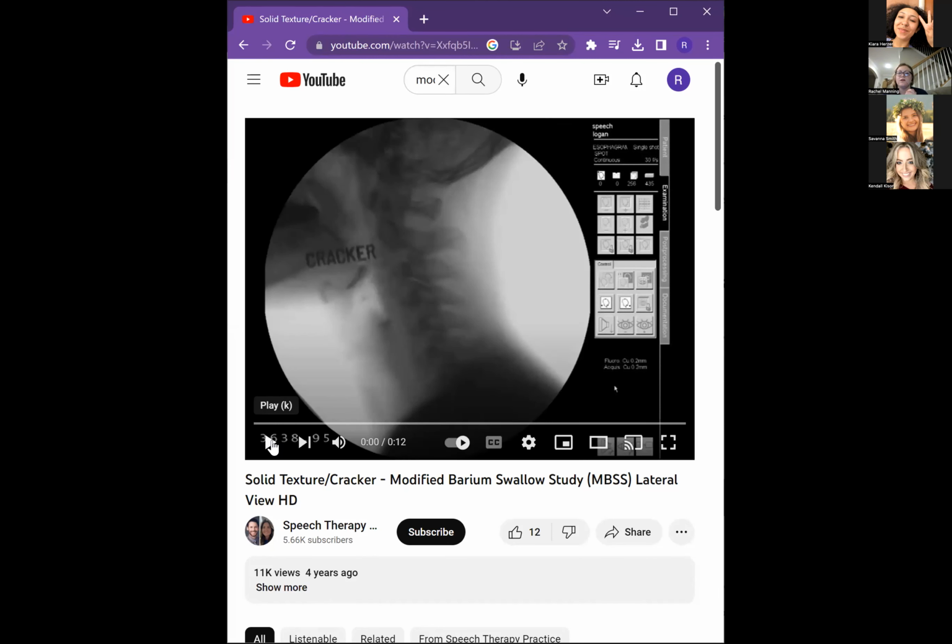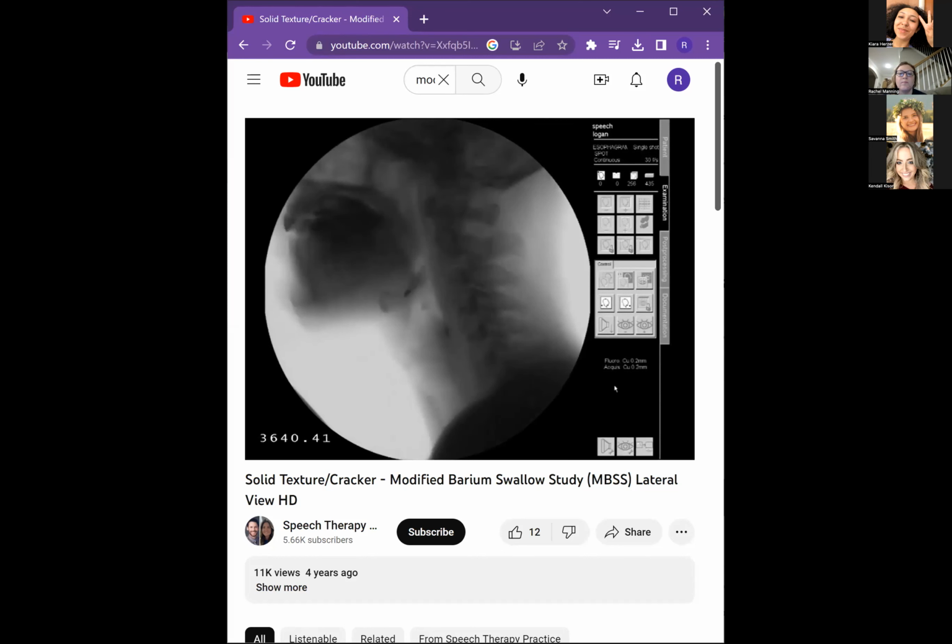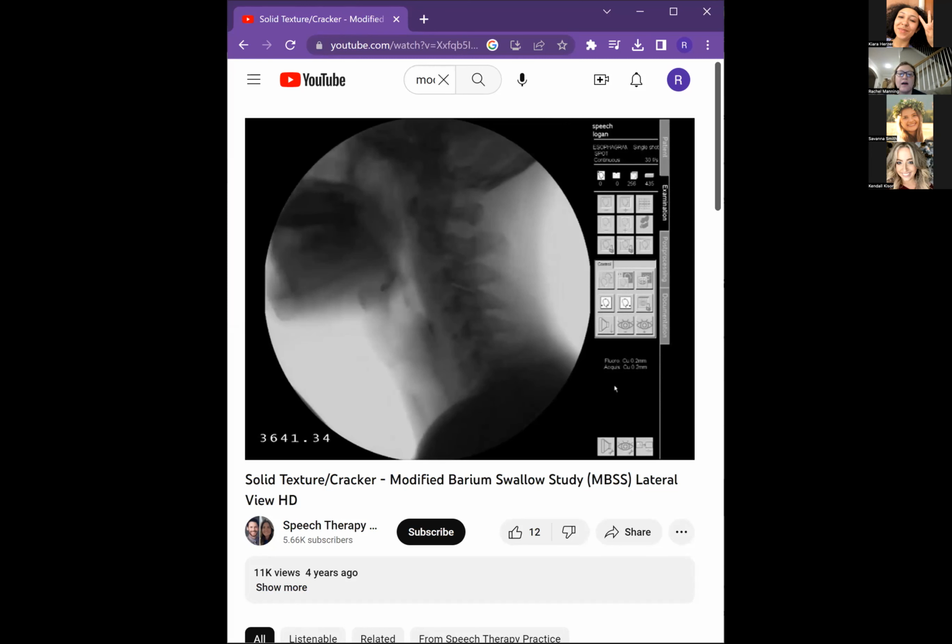Okay, so my name is Rachel Manning, and I am the speech language pathologist that completed this modified barium swallow study. So what we'll do is we'll watch the study, and I'll explain to you what's happening in the study, and then I'll take any questions. I'm gonna play it.